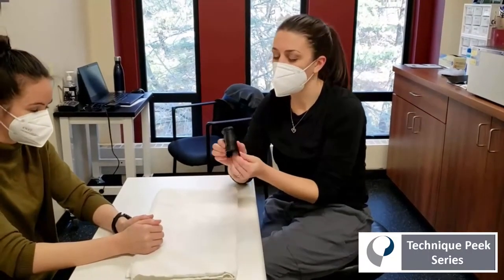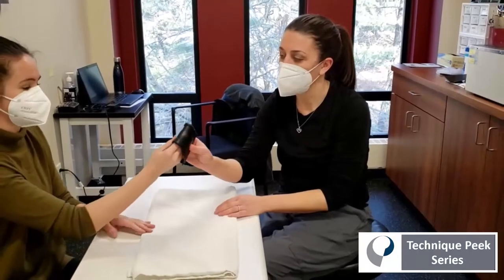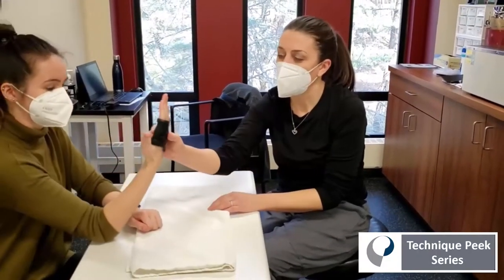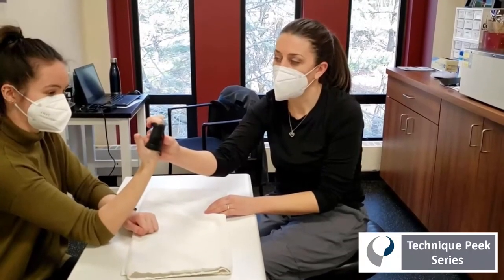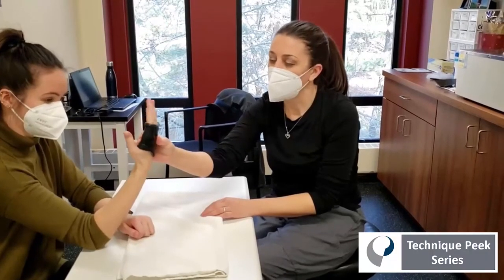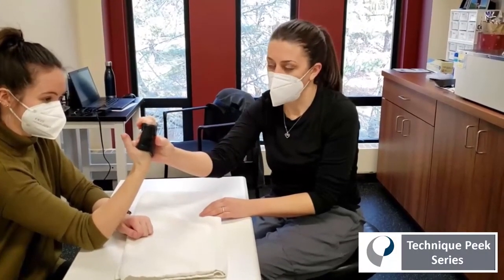This is what the finished product looks like. I'll have Janine demonstrate how it works. When she slides it on, it blocks the motion of her metacarpals, allowing her to focus solely on IP joint flexion and extension without compensating with the more mobile MCP joints.